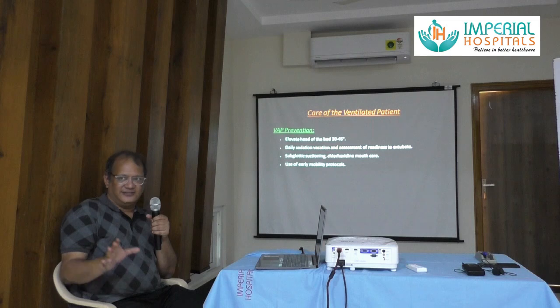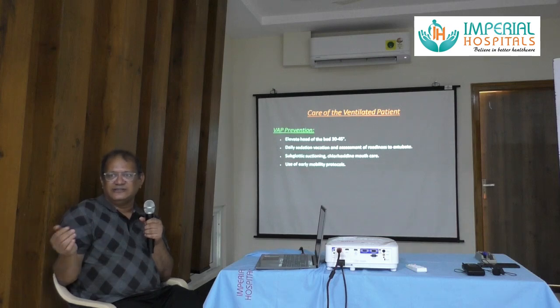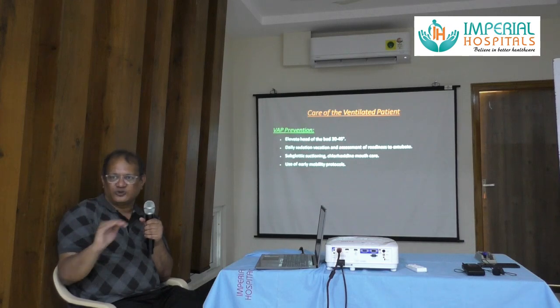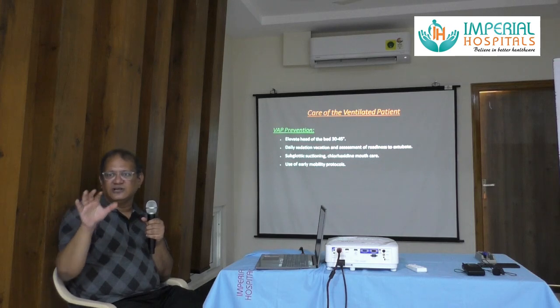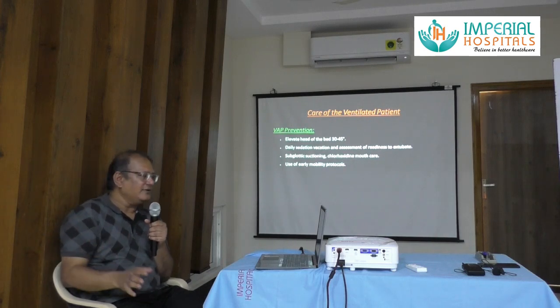Daily sedation vacation. What is sedation vacation? In ACMV or CMV modes, you will have to deeply sedate the patient. SIMV patients, obviously you will not sedate the patient, but if the patient is going to be sedated deeply, you want to give a window of period where you stop sedating the patient, right? And why do you want to stop sedating the patient? Because once the patient is sedated, respiratory drive will be down, right? You give a sedation-free window and check if the patient is getting ready to de-escalate, like from ACMV to SIMV to pressure support, right, to wean, right?